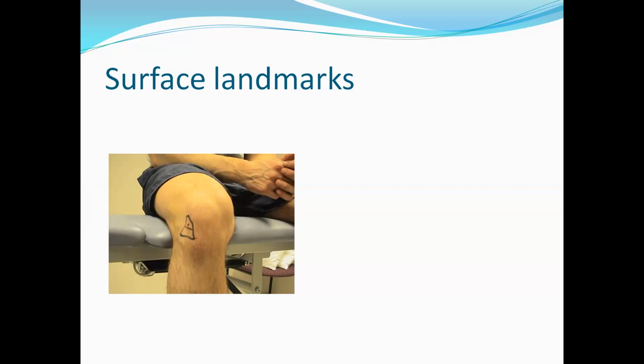The second thing is that the anterior horn of the lateral meniscus, and for the anteromedial portal the anterior horn of the medial meniscus, you may encounter on injection. You have not entered the right place. So for entering the joint through the anterolateral portal, you have to palpate the skin over the tibia, palpate the joint line, and go proximally. If you feel the joint line, there will be a sudden loss of resistance or depression here. You will confirm that this is the lateral joint line.